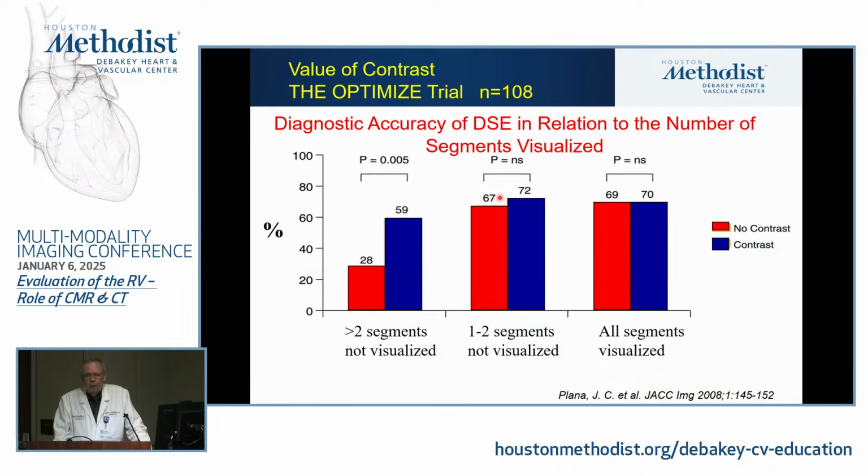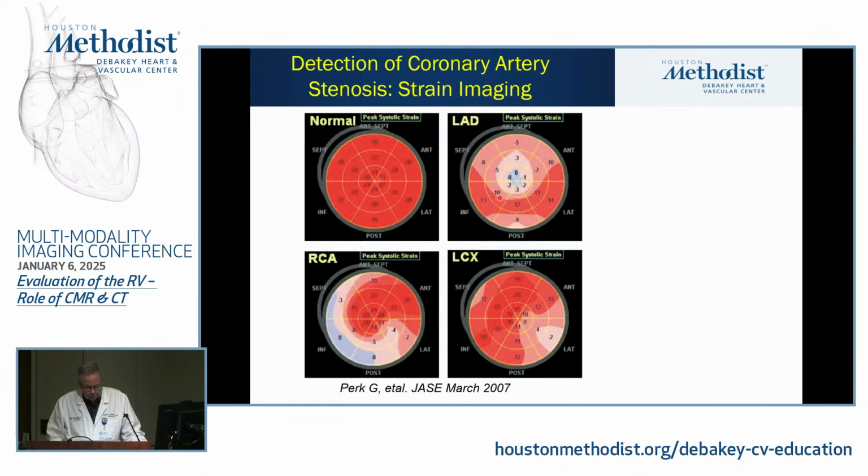that much. So we do a lot of contrast in our stress echo techniques, but it's because we are in Texas and we have a lot of patients that at rest you don't have full evaluation of all 17 segments. But if you have a very nice quality resting echo, don't use contrast. In fact, contrast sometimes can make your life more difficult because you can introduce some artifacts.